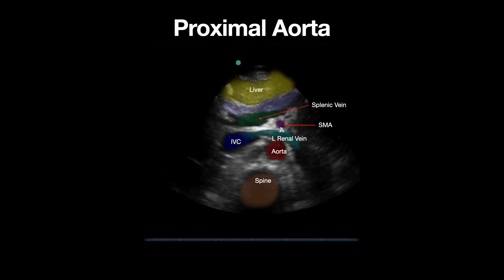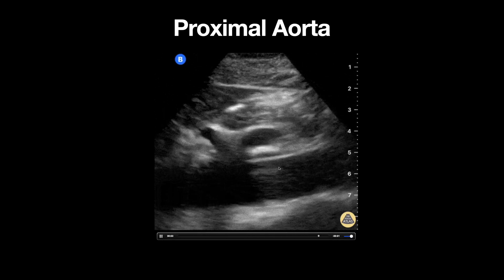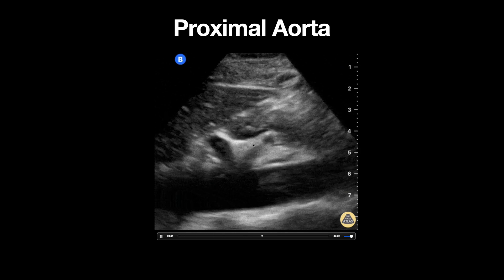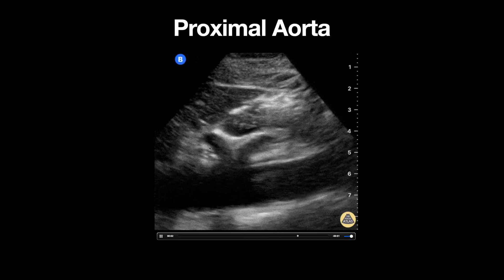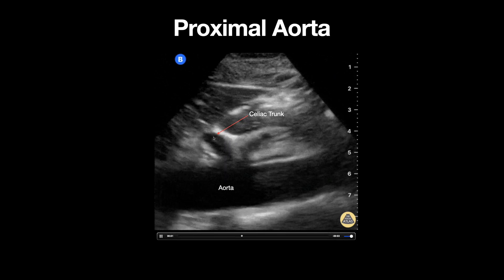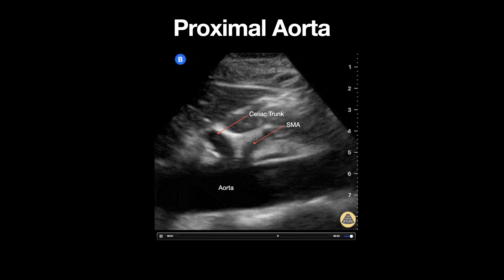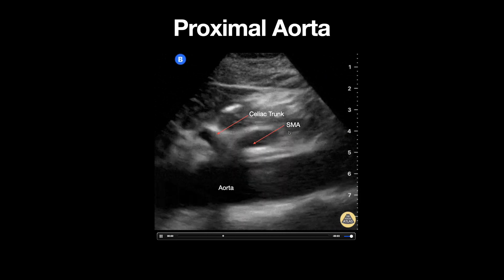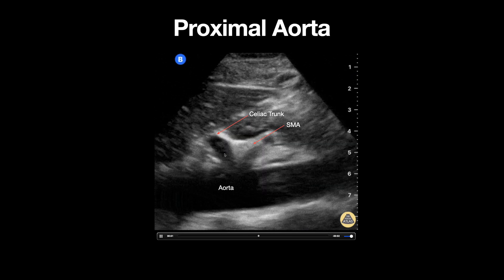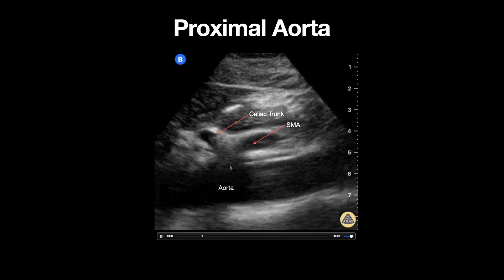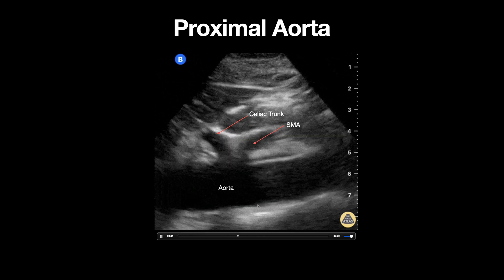Now, if we turn the probe 90 degrees and obtain a longitudinal orientation of the aorta, we can appreciate two tributaries seen coming off the aorta. The more proximal one will be our celiac trunk, and diving more down towards the feet will be our superior mesenteric artery. Always remember that when evaluating the aorta, we should evaluate in two planes — transverse and longitudinal — ensuring that the aorta is not greater than three centimeters.